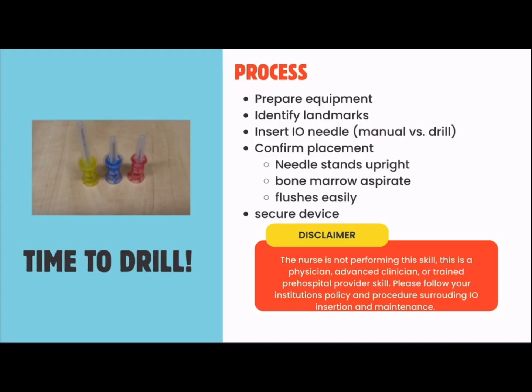So it's time to drill. What is our process? Just a general disclaimer here, the nurse is not performing this skill. This is a physician, advanced clinician, or trained pre-hospital provider skill. As always, follow your institution's policy and procedures surrounding IO insertion and maintenance. But I find that if I know the steps and the process of a skill, even if it's not my job to do the skill, I'm able to better care for my patients by knowing the process.